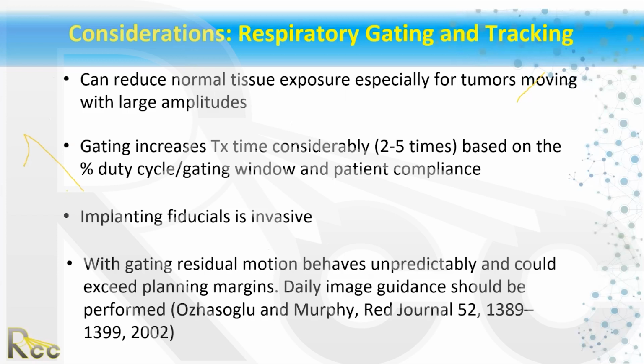6-hospital department. One of our departments has an ExacTrac system with cone beam CT on a Novalis TX machine, and other systems have the Edge, where it's just a Varian Edge that we're using without the ExacTrac. We've looked at our own data. We've actually published our own data, and what we found is that it's very similar.